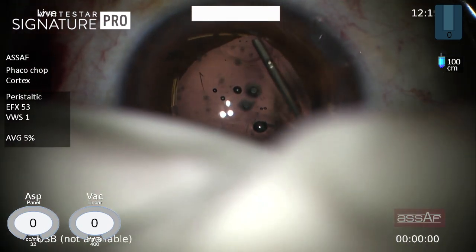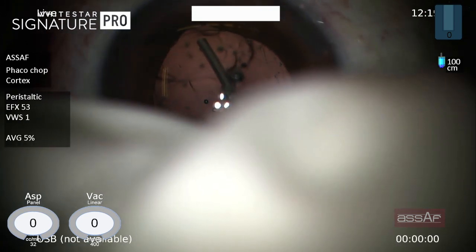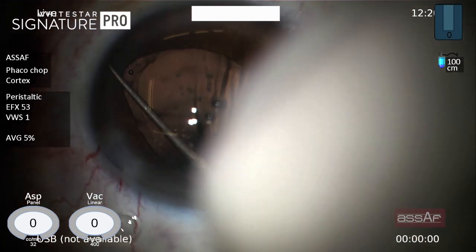Now injection of dispersive OVD between the iris and the anterior capsule, preparing for sulcus implantation of a three-piece IOL. Checking for the integrity of the rhexis — everything looks fine.